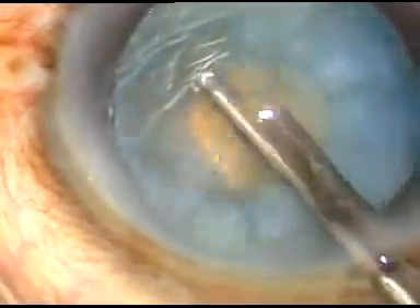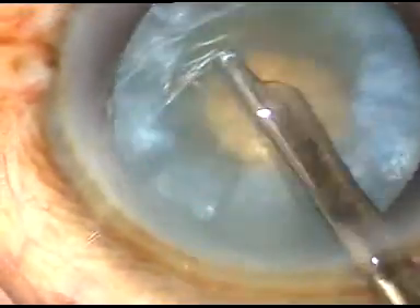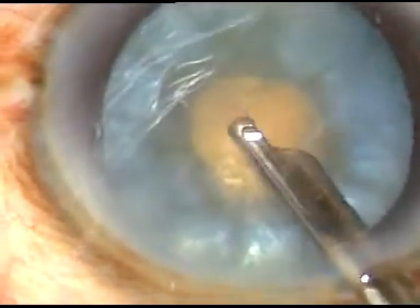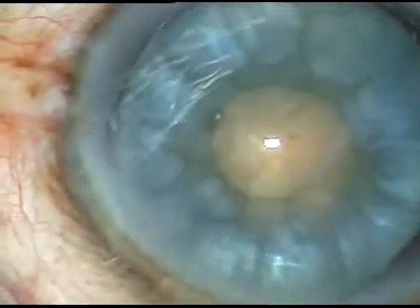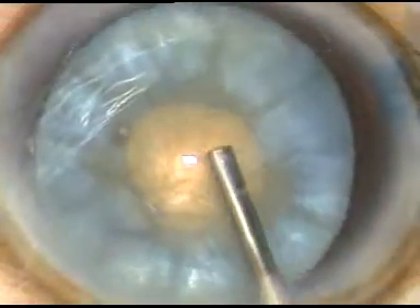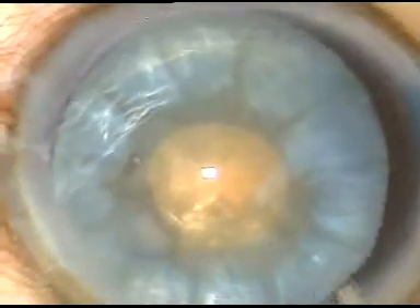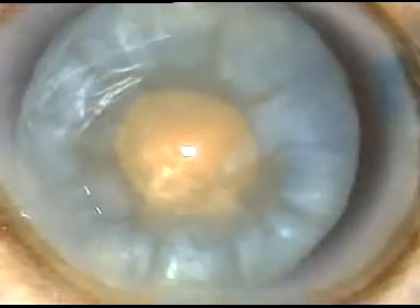Rotate the nucleus and aspirate some cortical lens matter from all around. A lot of cortical lens matter need not be aspirated. Some amount of aspiration of cortical lens matter, if done, reduces the intralenticular pressure drastically, and we can enlarge this rhexis very comfortably.